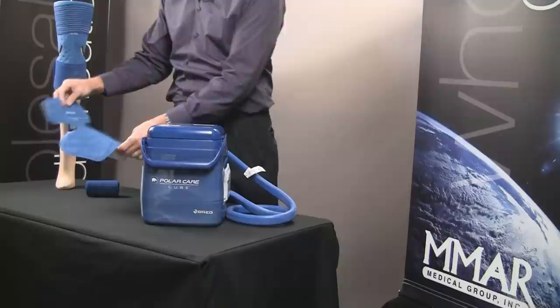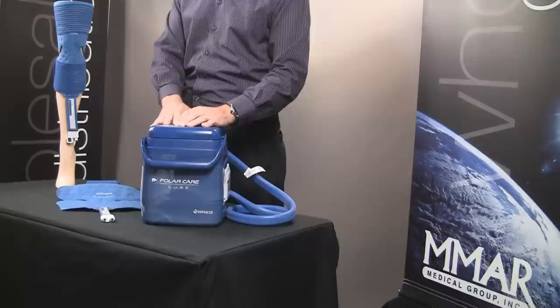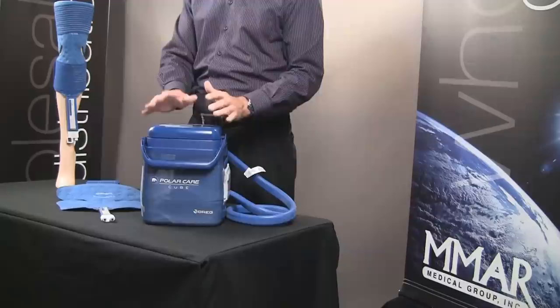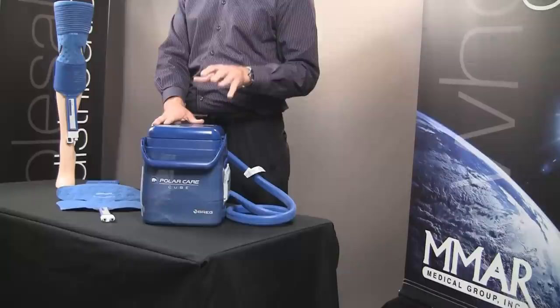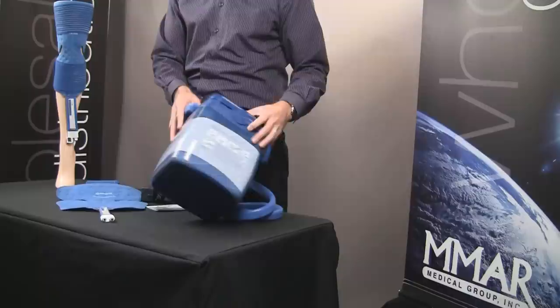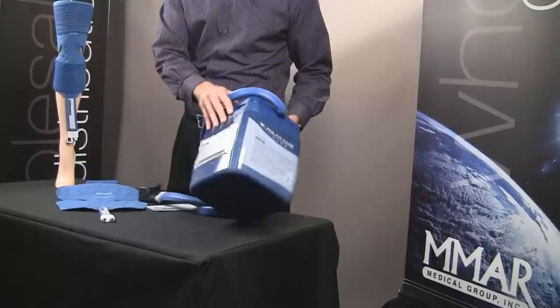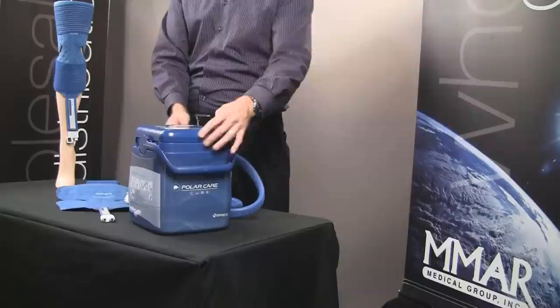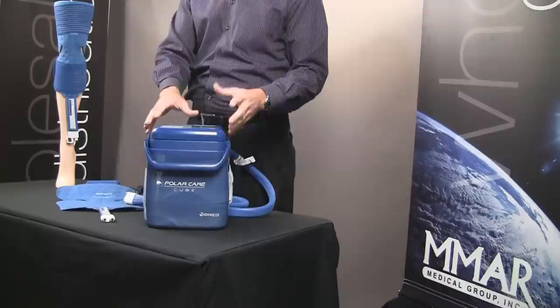We also recommend that you do skin checks every one to two hours, looking for odd discoloration or blistering of the skin. If you experience that, discontinue cold therapy immediately. There are also risk factors and contraindications involved in using continuous cold therapy, and Breg does a good job providing education to patients. You'll see warnings and indications on the cooler, and every unit comes with a packet that provides warnings, contraindications, and risk factors. Most importantly, consult your physician on how they want you to use this device effectively.